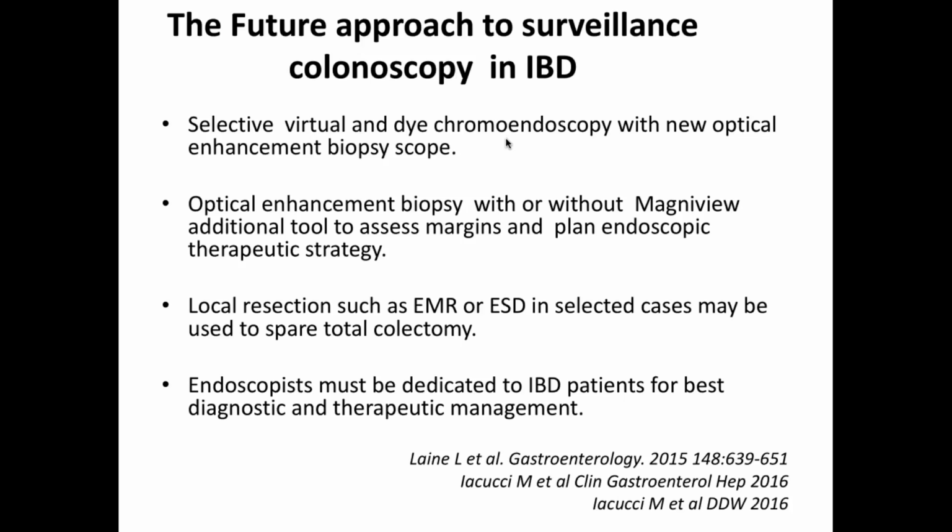The techniques are endoscopic mucosal resection and/or endoscopic submucosal dissection. The Japanese do the endoscopic submucosal dissection fantastically. And definitely, I think we need advanced expertise in endoscopy. But if you can really characterize your lesion and it is isolated, the margins are defined, there is no invasiveness or prediction, you can use EMR or ESD to resect the lesion.